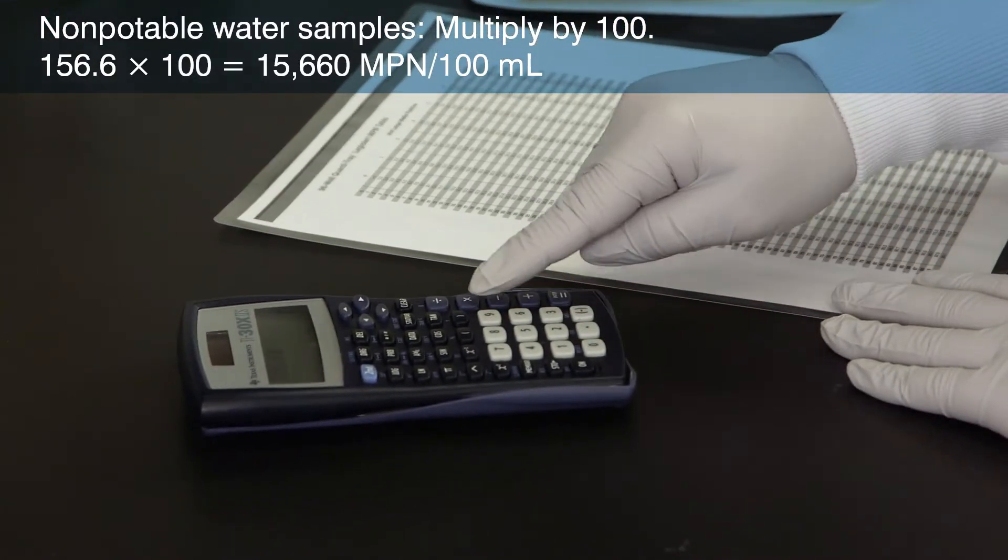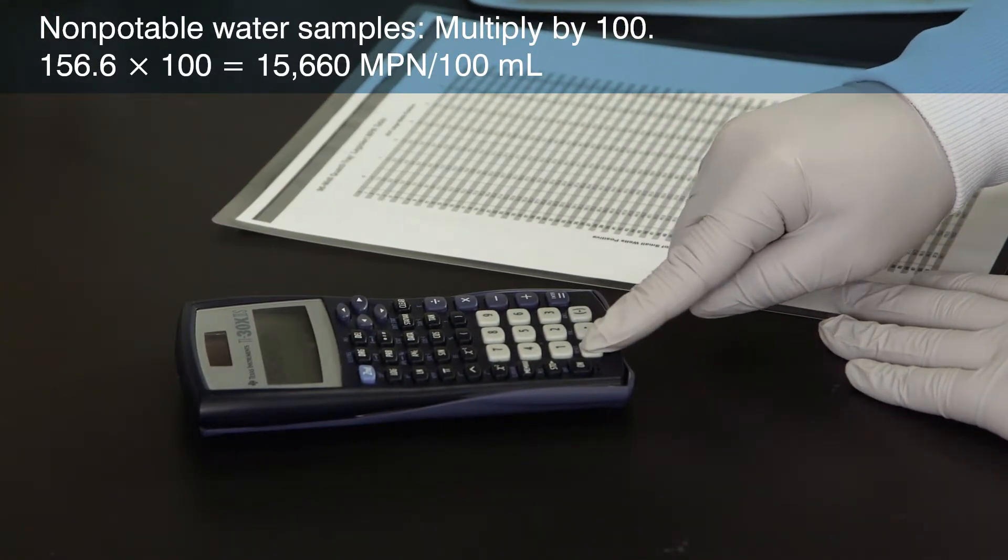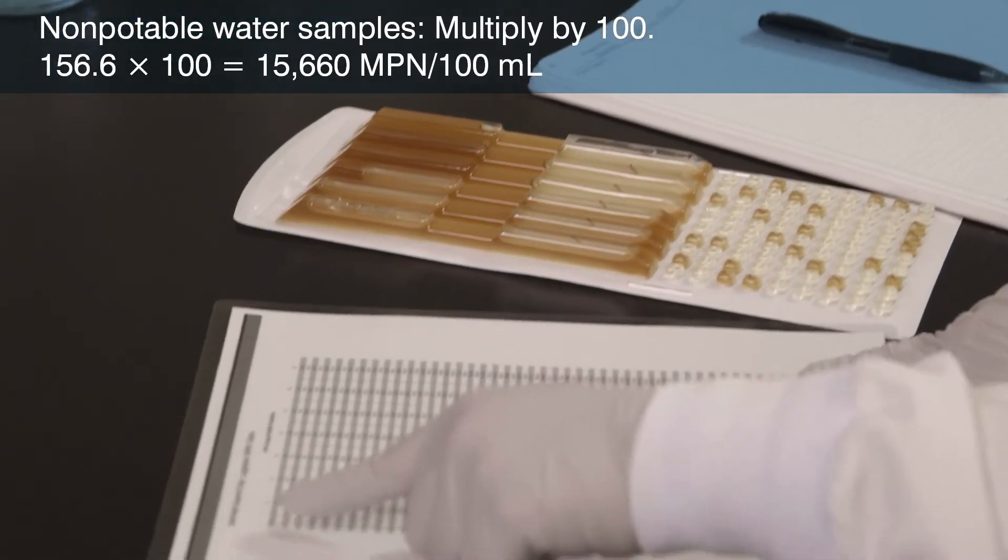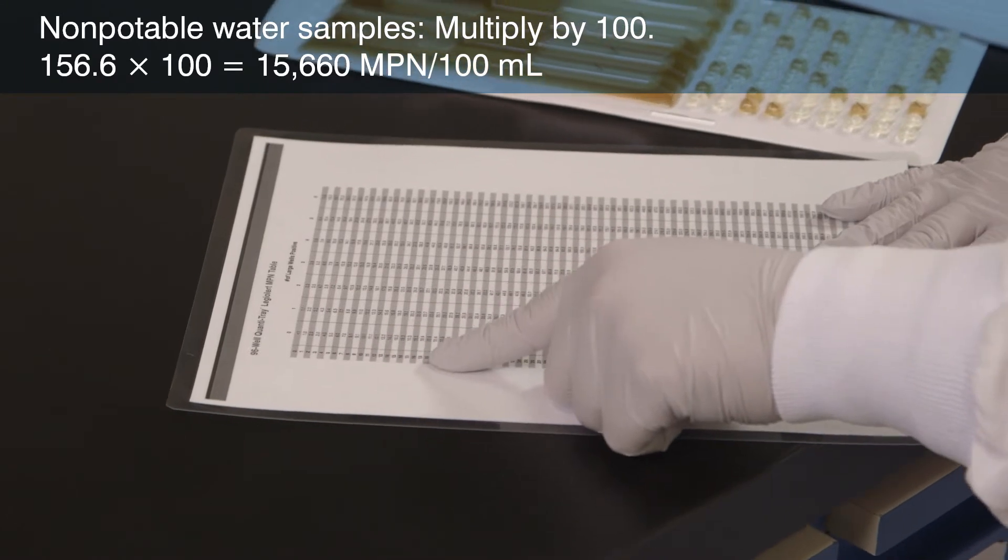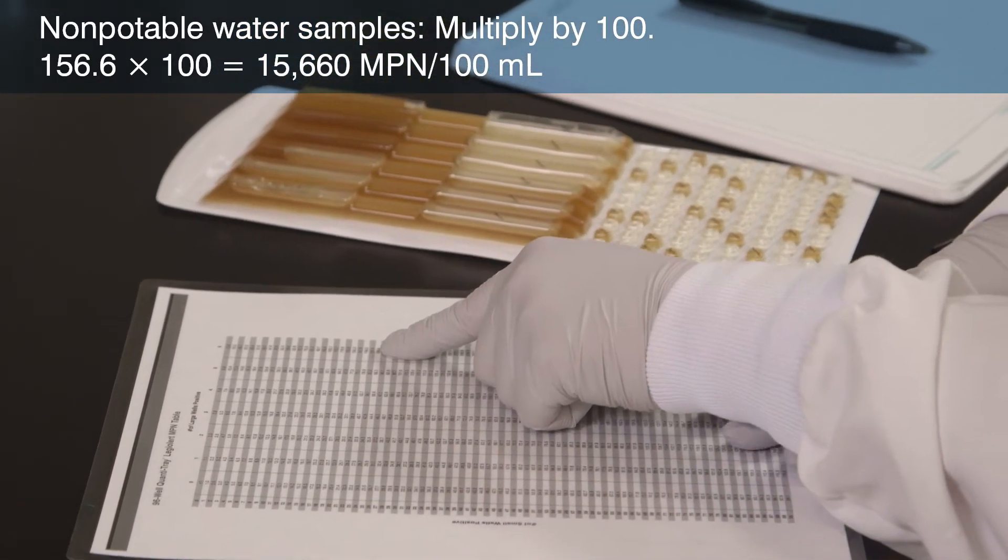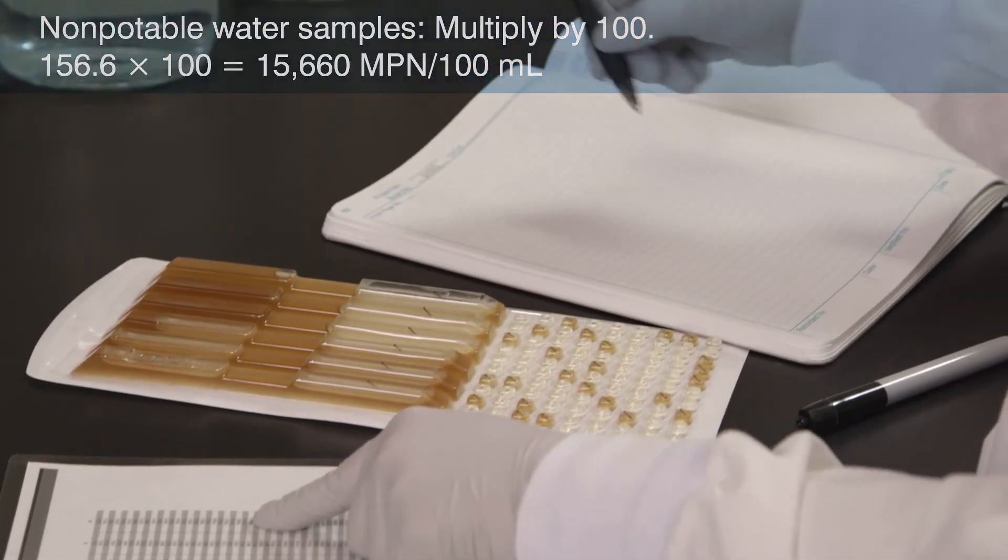To obtain the MPN per 100 mL, remember to multiply the MPN by 100 because you're using 1 mL of the original sample. The most probable number for this non-potable water example is 156.6 multiplied by a dilution factor of 100 to achieve 15,660 MPN per 100 mL.